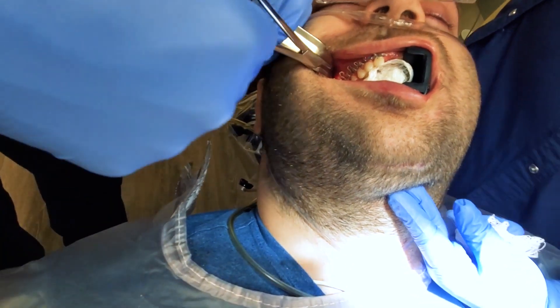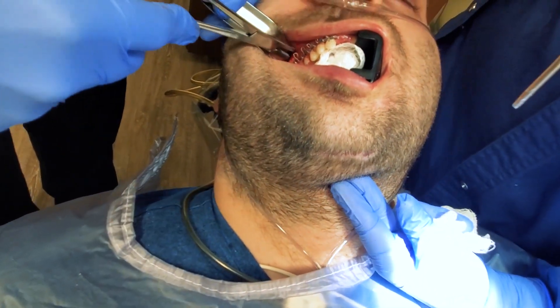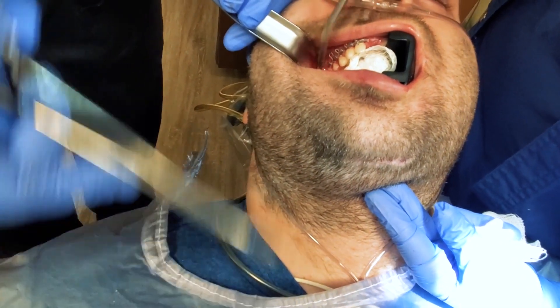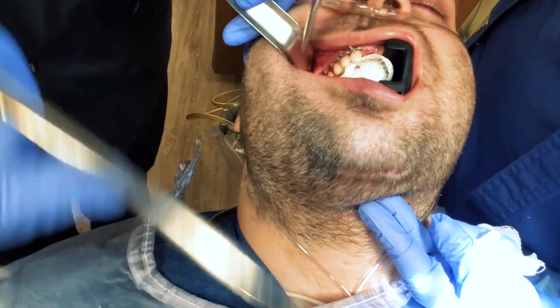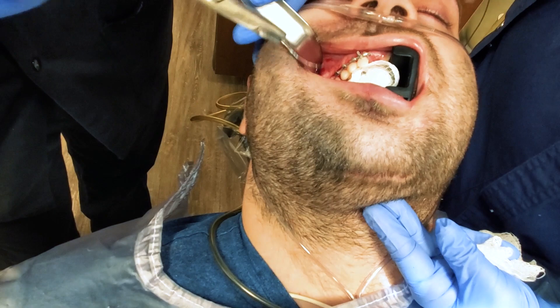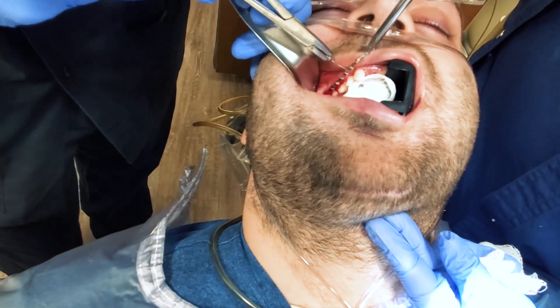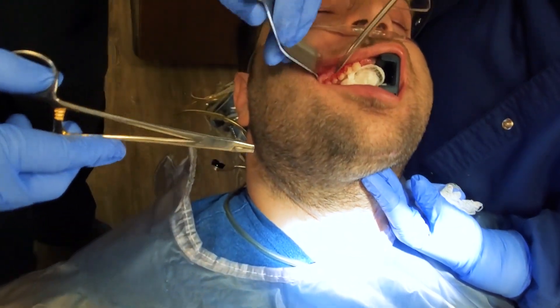This is not the most elegant looking procedure. Pull and the wires come out. That one — the whole wire didn't come out, so I've got to grab the rest. Just kind of keep going here, sneak these bad boys out, before you know it the arch bar comes out. And that is how you remove the arch bar.